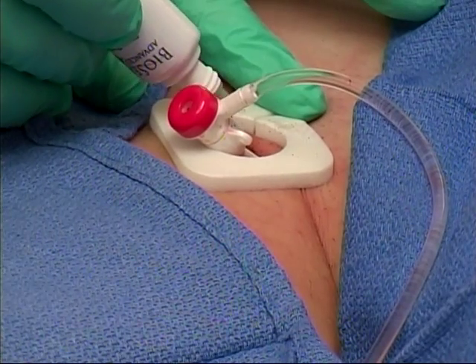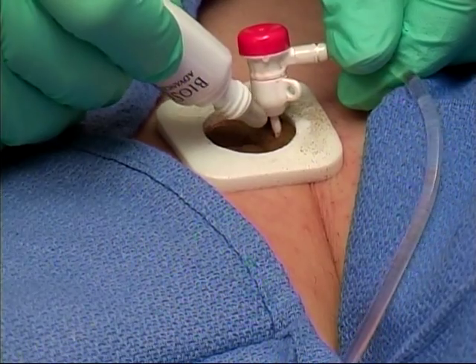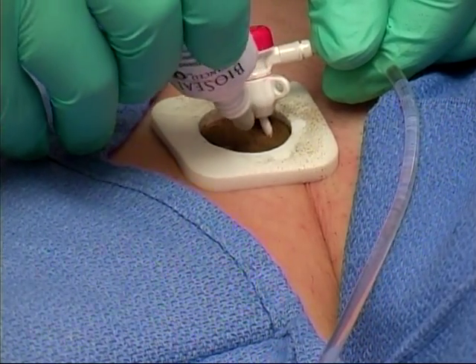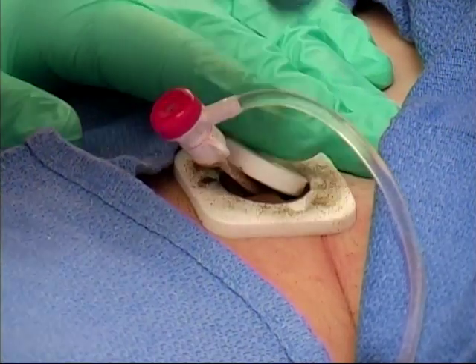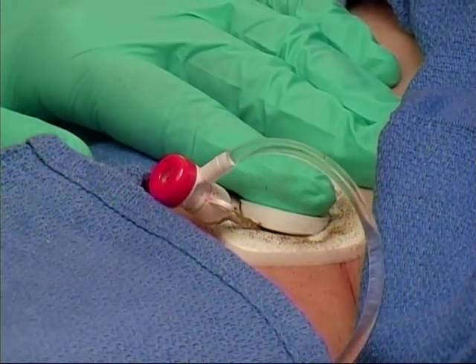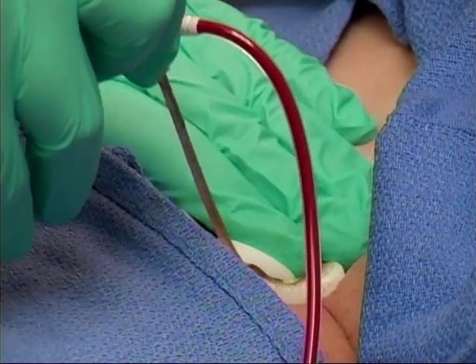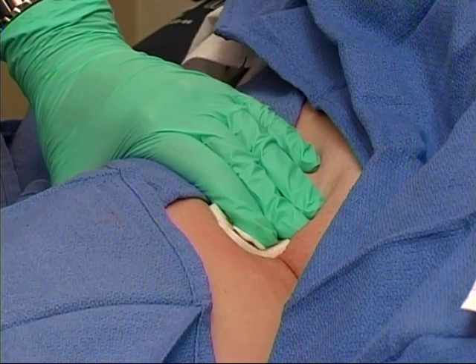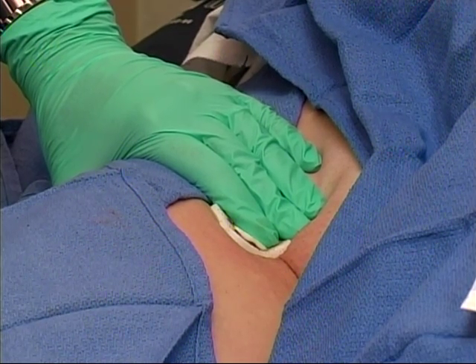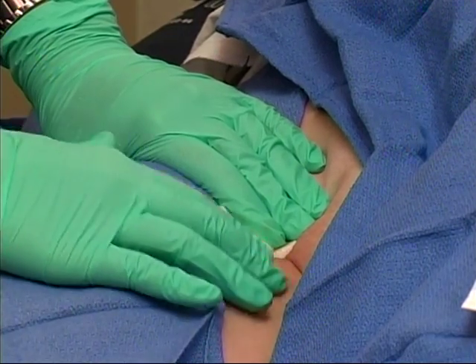Applying BioSeal Advanced Powder prior to removing femoral and venous sheaths following a cardiac catheterization or interventional radiology procedure forms a microbial barrier that prevents post-procedure bleeding and infection by allowing nothing in and nothing out, even for anticoagulated patients. Hold times are significantly decreased, increasing patient satisfaction thanks to this exciting new technology.